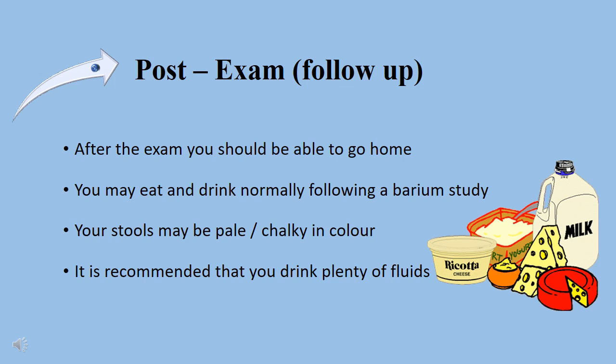After the exam, you may experience mild dehydration and constipation. It's normal for your stools to be pale colour afterwards. This is the result of the barium leaving your digestive tract. It's also advisable to eat fresh fruits and vegetables in the days following your barium study. If you experience severe constipation or absence of the bowel movements, please contact your GP immediately.